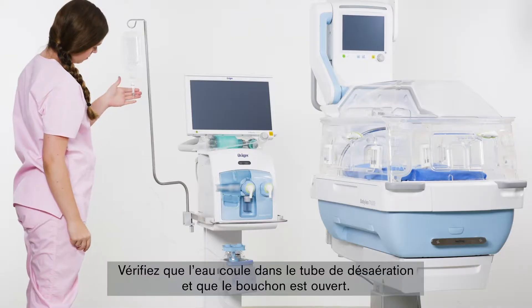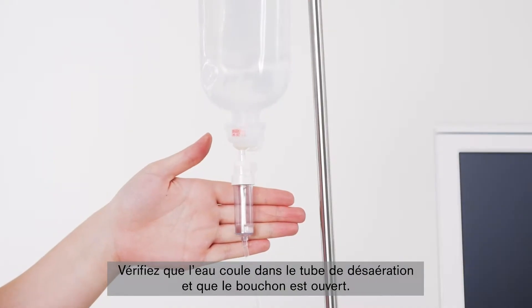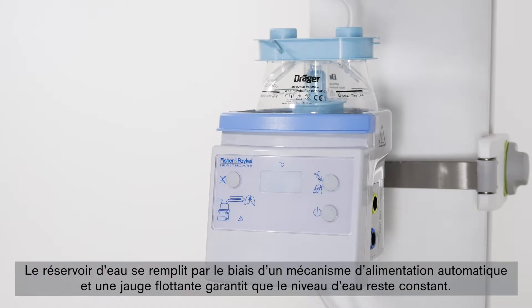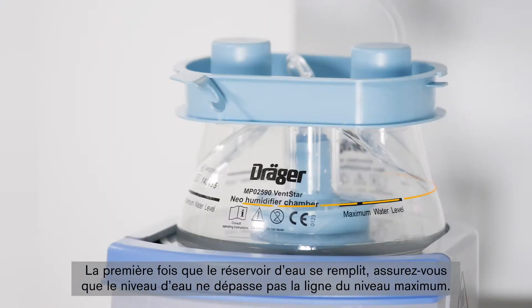Be sure that the water flows into the deaeration chamber and that the sealing cap is open. The water chamber is filled automatically by means of the auto-feed mechanism, and a float gauge ensures that the water level remains constant. The first time the water chamber is filled, be sure not to go beyond the maximum water level mark.